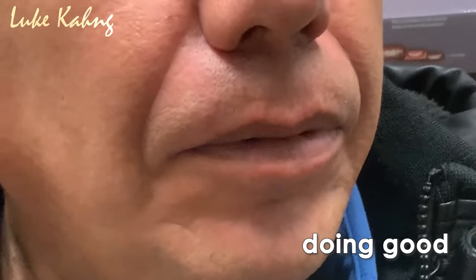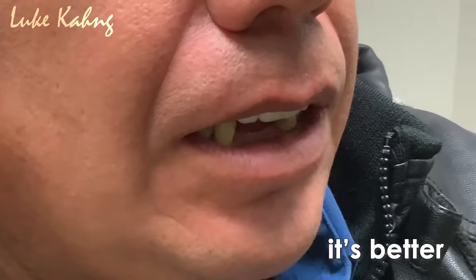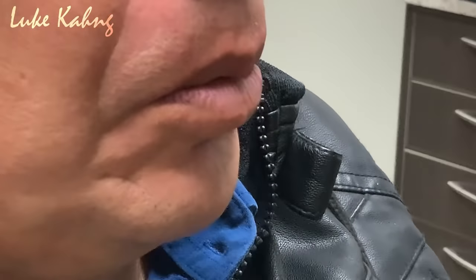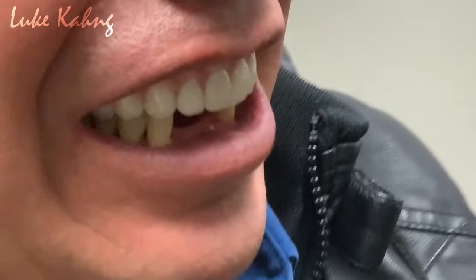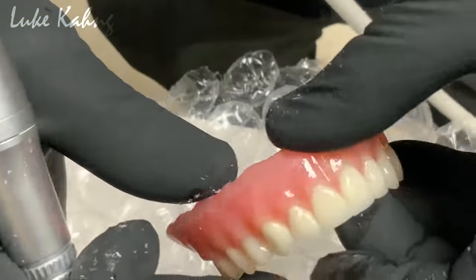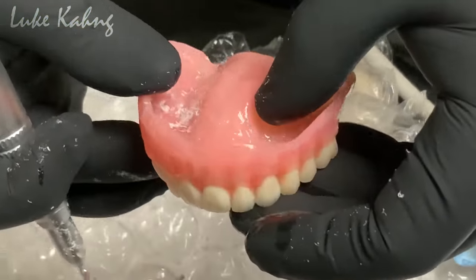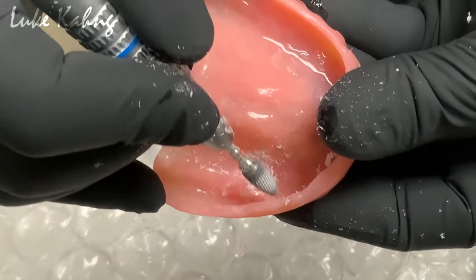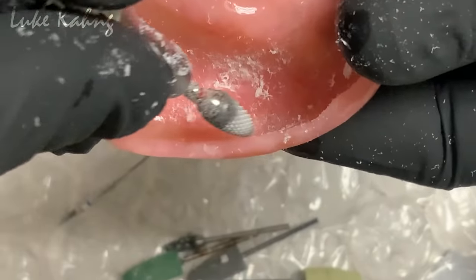¿Quién está bien, me? Mejor. Make you mejor. Nice. There we go. That's it. We started with the full denture, and now look at where we are. See, look at that. Perfect fit. Now the patient says everything is perfect except just this little tiny area right in here. Just a little bit right here.